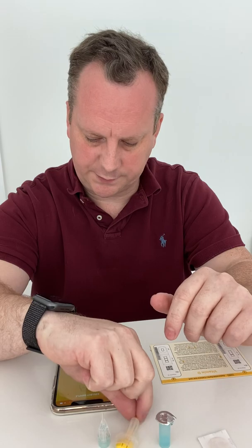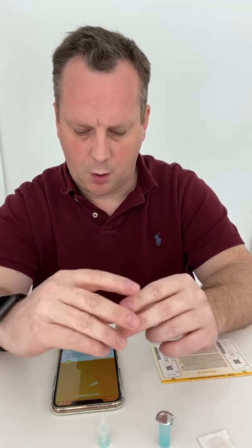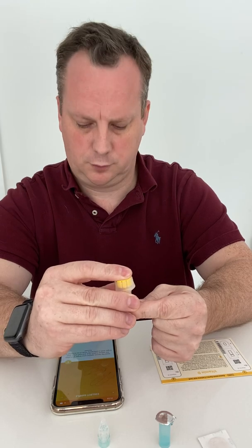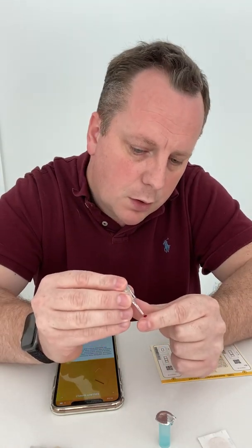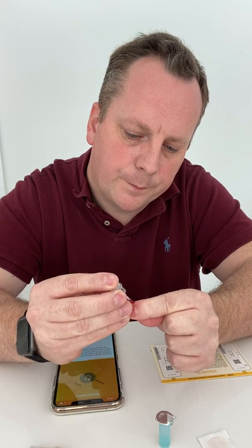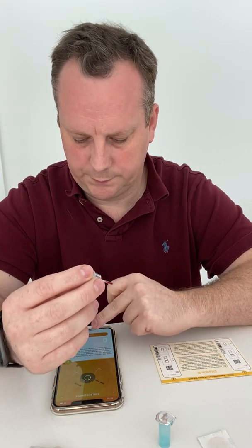Remove the safety lancet from the lancing device — just a twist. Hold the lancet against the finger and press the yellow button until I have a sufficient blood sample. That's fairly painless. Now I have to take the capillary tube to the blood sample and fill it to the line. As easy as that. Completed.